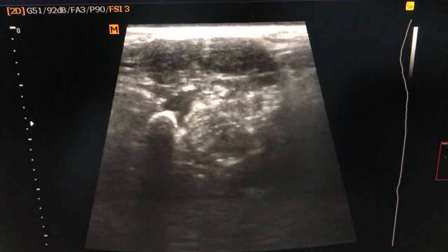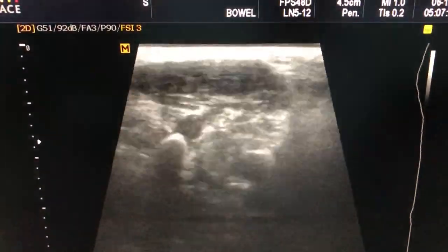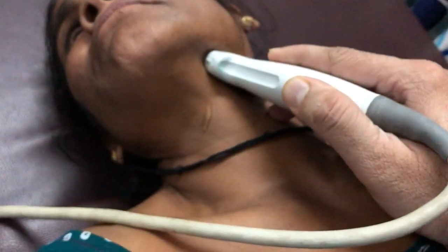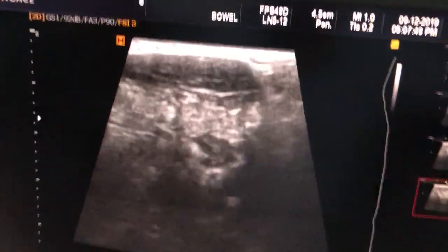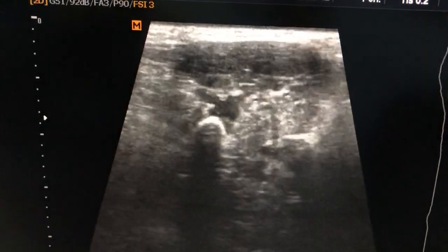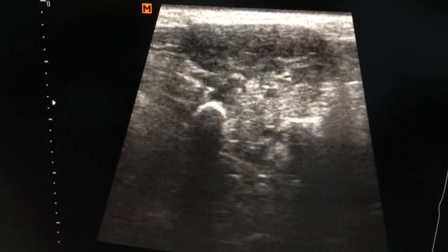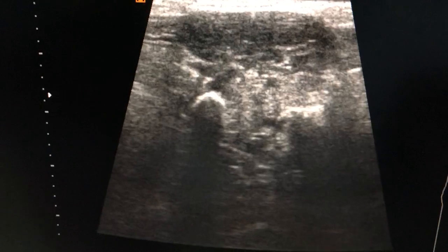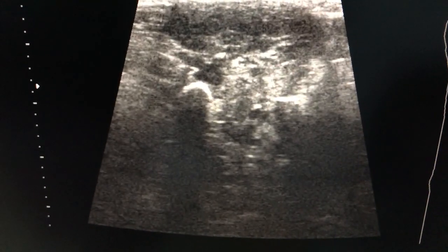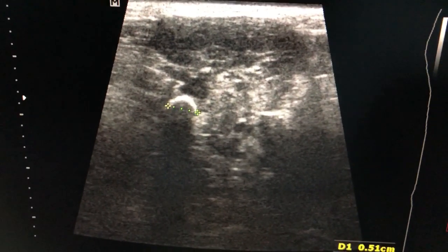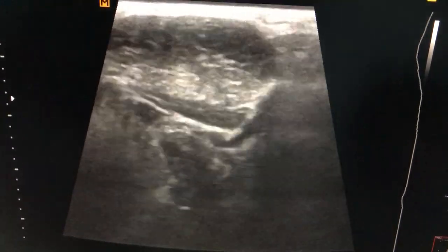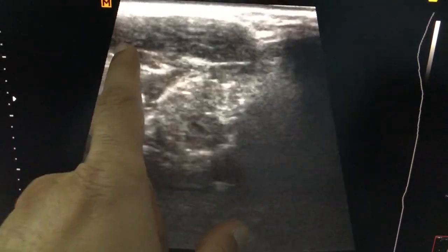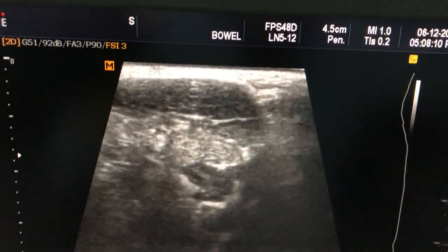This is the duct, and the probe is placed over here like this. You can see the posterior acoustic shadow very clearly. The size of the calculus is 5 mm. The rest of the texture of the submandibular gland is normal.